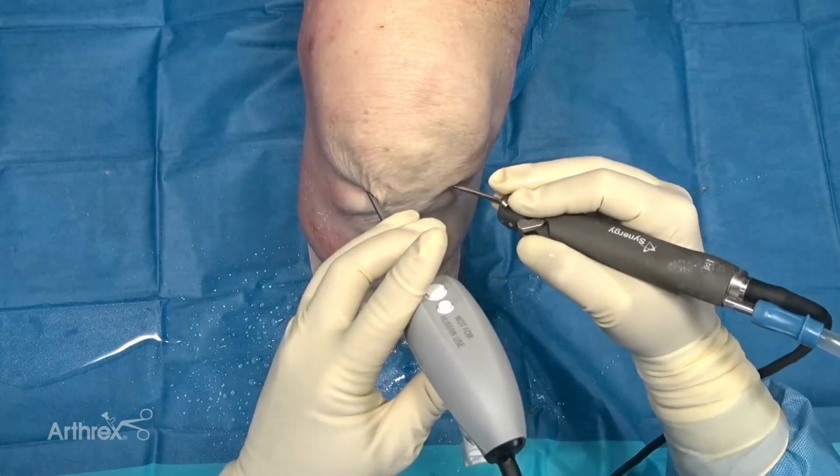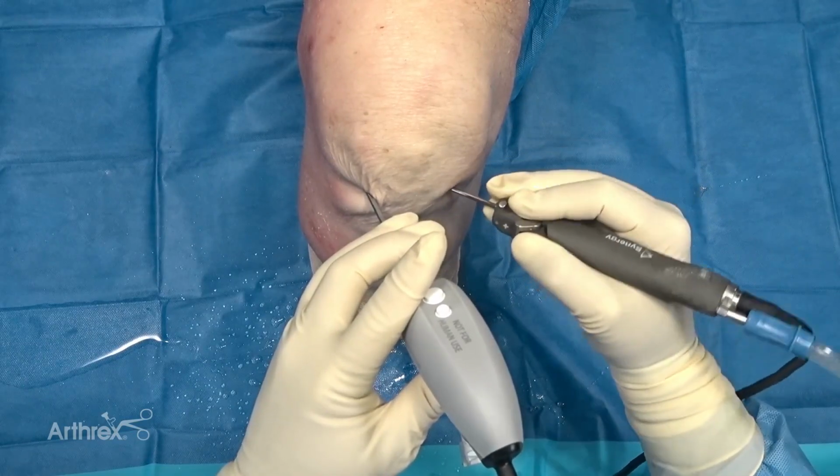You can see the percutaneous portals that we're working through. We can get all the way back to the posterior lateral corner of the knee from a standard knee medial portal placement. And that's a game changer when we're talking about nano instrumentation. We're going to work on the posterior horn slightly. You could also come in here with a nanobiter, obviously, to finish up the partial lateral meniscectomy. But this is doing an excellent job at giving nice smooth edges to work with.